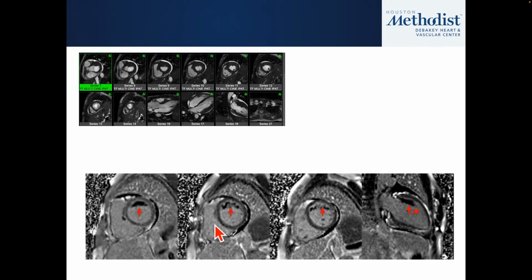But then I think when we couple that with our delayed enhancement MRI, you see, in fact, that this area where we saw increased wall thickness on the cine actually has several components to it. There's the normal myocardium, which is out here in the epicardium, and then there's this area of tissue right here, which has a peripheral rim of contrast enhancement, but a central area of absent contrast uptake. And this is the classic finding that you see in Loeffler's myocarditis, where there's this inflammatory layer that sits on top of the myocardium, and it's composed really of inflammatory cells as well as thrombotic cells.